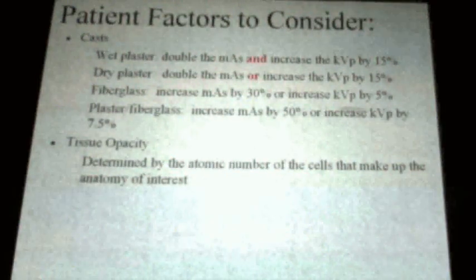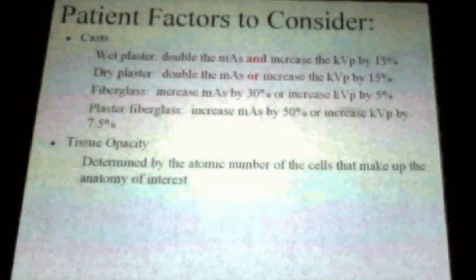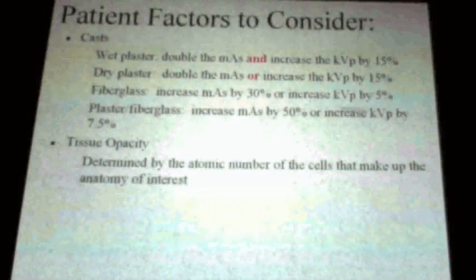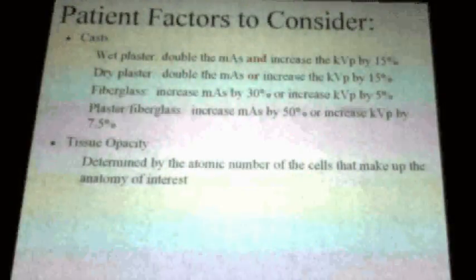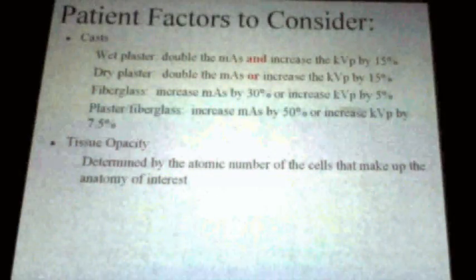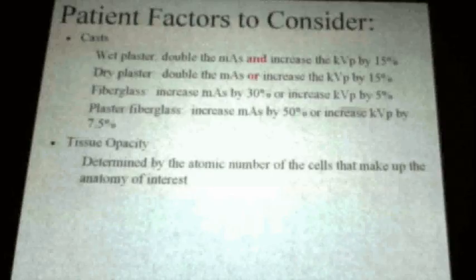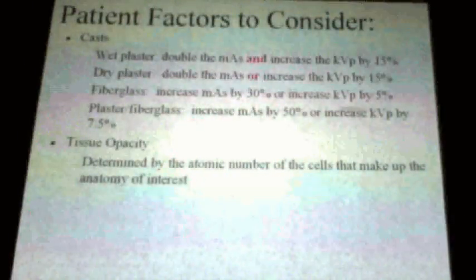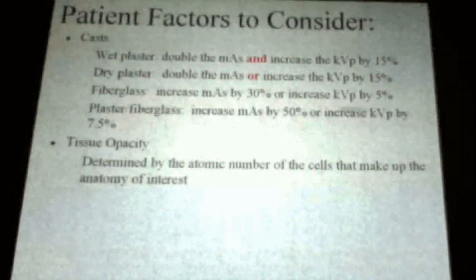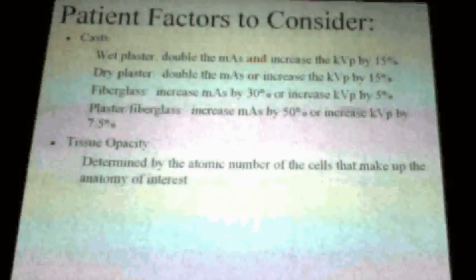But you know how it attenuates it? It's the same thickness and it's the same atomic number throughout the whole table. And because it's like that, if the table had a different thickness to it, it would show up. But because it's the same thickness and the same Z number throughout the whole table, it's like it's not there. Okay? The table has no contrast.